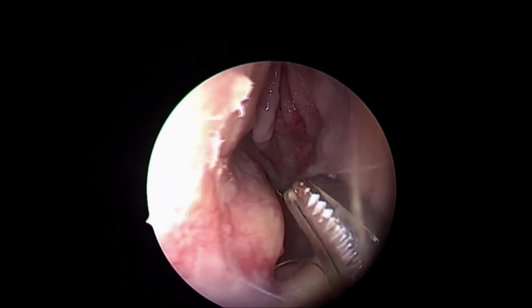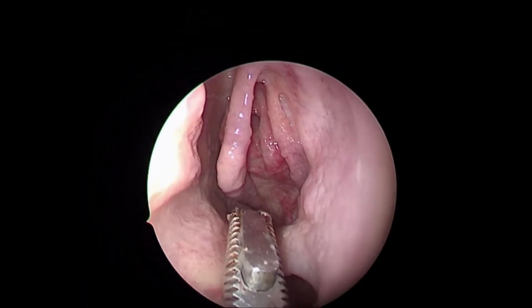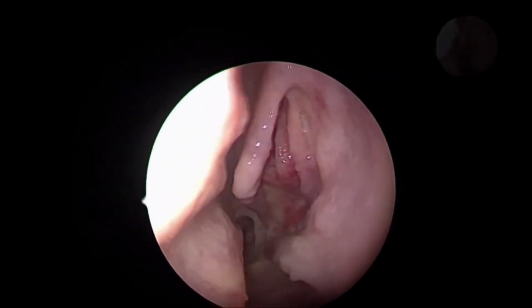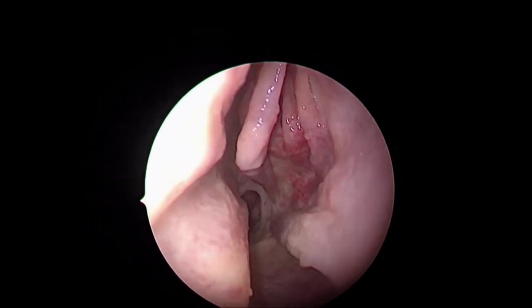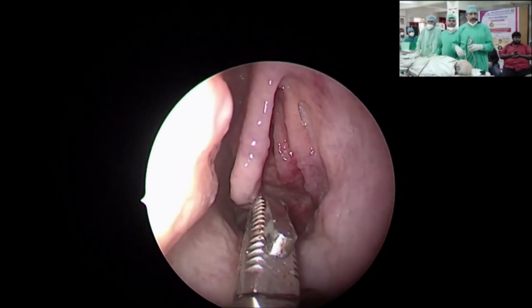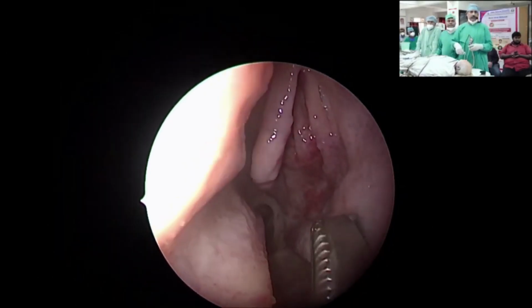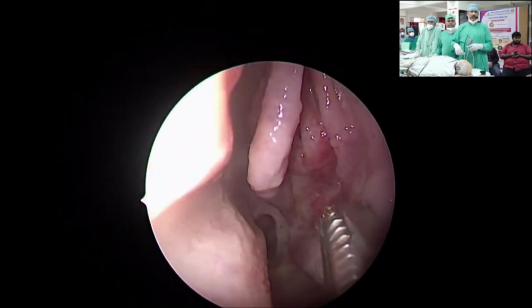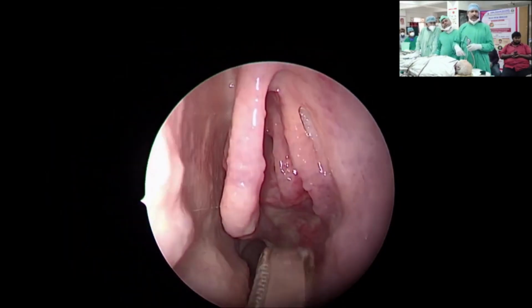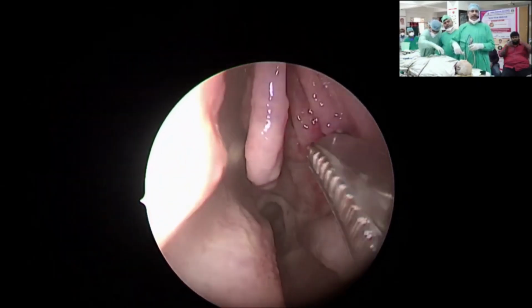Also, Dr. Vinay Kule from Navi Mumbai wants to know the exact location for maxillary ostium and accessory ostium and the mucosal fold over it. So can you just show it once again? Yeah, I will show if there are accessory ostium and show the importance of it. Clinically, what is the occurrence of accessory ostium in your surgical practice? It's variable. But yes, in 20 to 30% of the patients you can get it. But the importance is, once it is there, you have to communicate it to the natural ostium; that is always better.